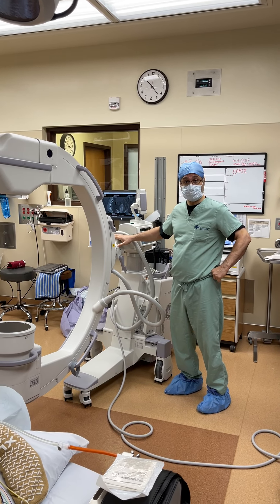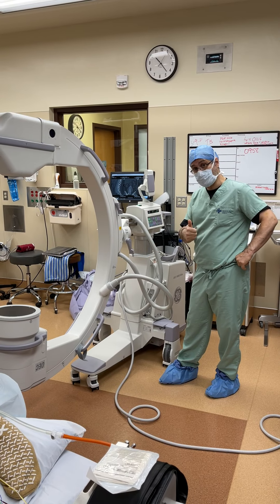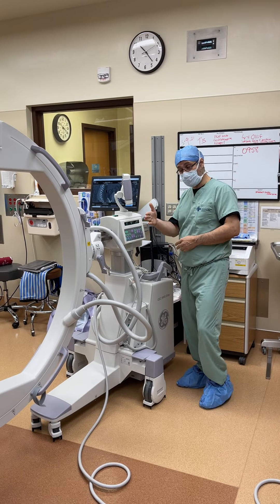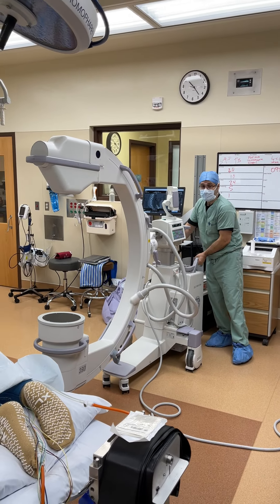This is the Super G. The Super G has another piece that comes here and has one more axis of freedom. But this is the regular one, so we are going to go straight with this one. I will make another picture with the Super G.